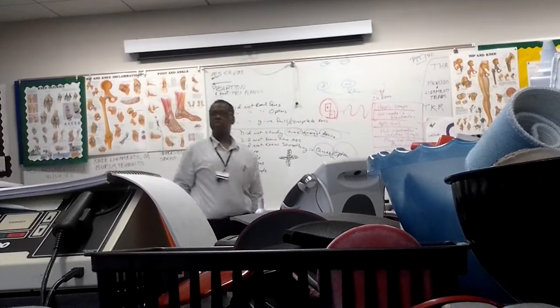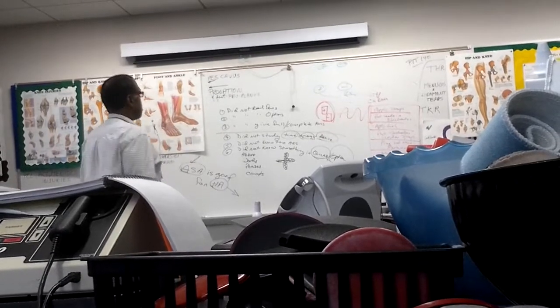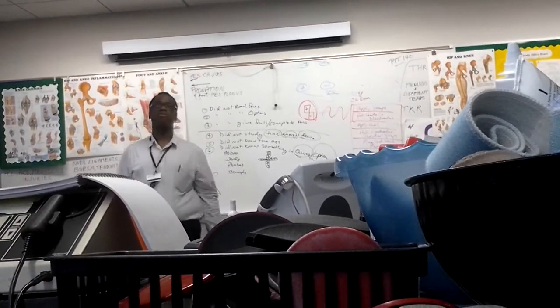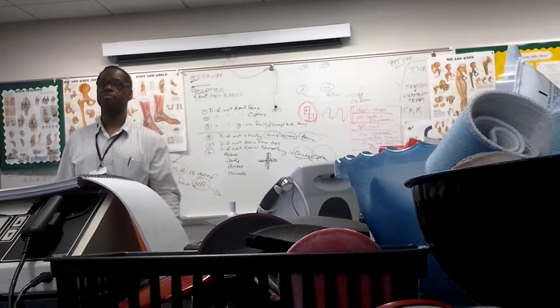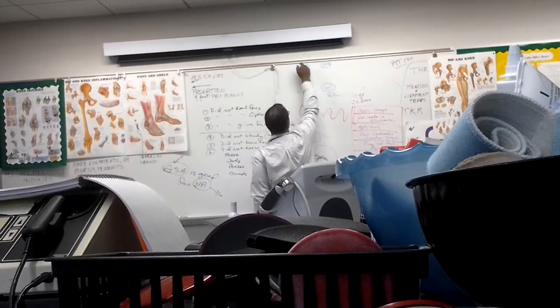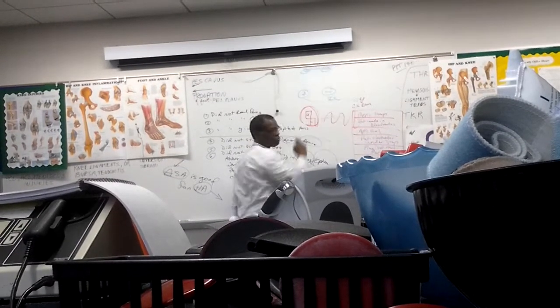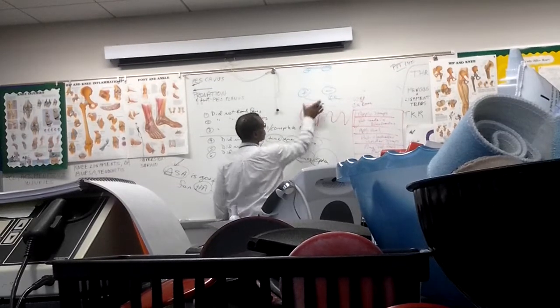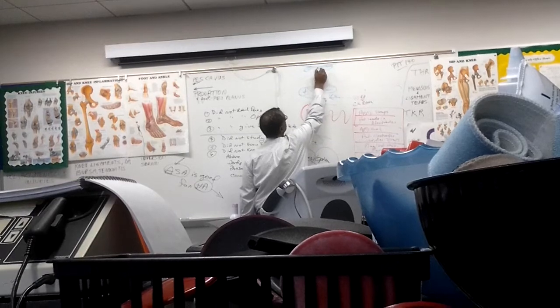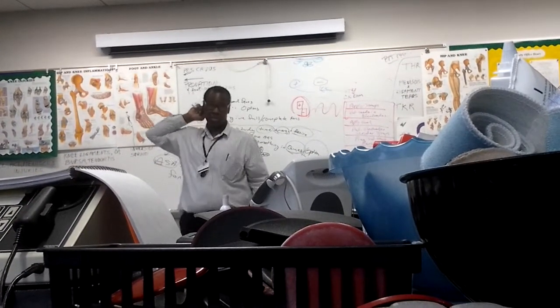where is the vector going to tend to stay closer to? The small size. Good. This would be a good treatment for pain in the paravertebral muscles of, let's say, C3. Why? Because then I could put the small pad right there underneath the skull. I can put two teeny ones right there. I can put some large ones here on the upper trap. The vector is going to stay closer to the smaller pad, and I can treat right up there.